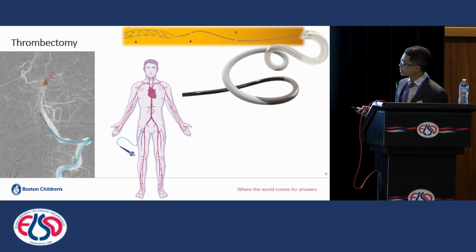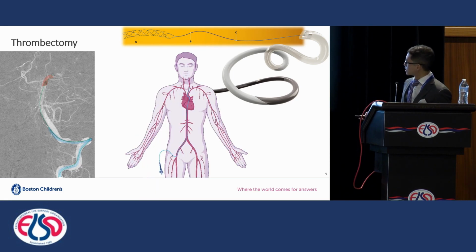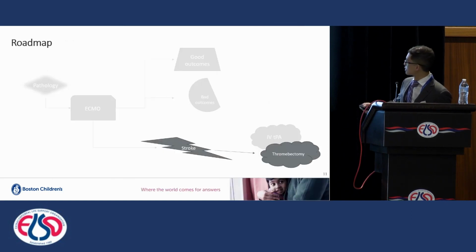You see these 3 dots here, 3 dots here, 3 dots here, and 3 dots there. That's that stent retriever opened up across this red highlighted thrombus. It's actually all black and white, so I never have someone color annotate it for me during the cases. Here we see that catheter is brought up transfemorally, or nowadays in adults transradially into the carotid in most situations.